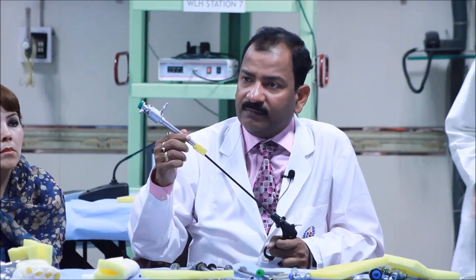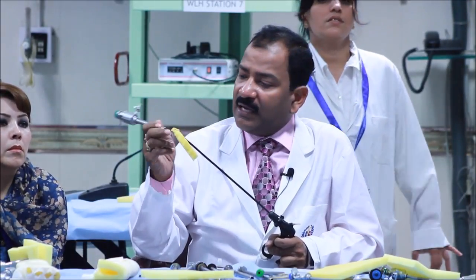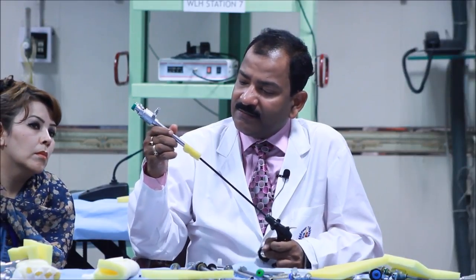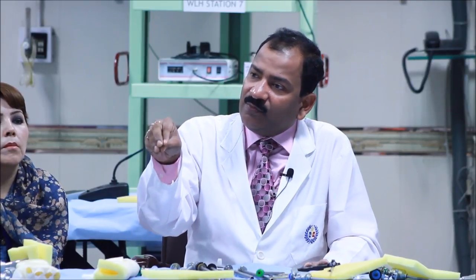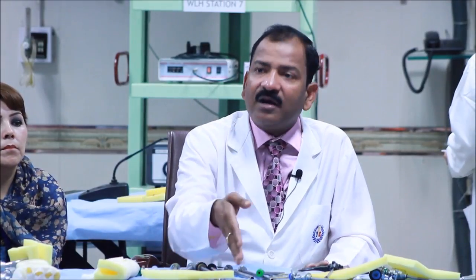But it has one problem. Do you know why? Because the instrument has already taken 5 mm, and only 5 mm is left for your effective retrieval. So when you are entering it, sometimes it can tear. It can puncture the gallbladder, and a lot of bile can drop inside. And because you are not seeing, you think it didn't happen. Do you know why? Because once you are rail-roading, your telescope is seeing into the cannula only, and it is not seeing all the bile or infected material which has been dropped inside.